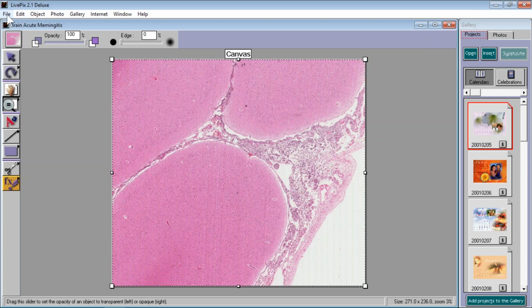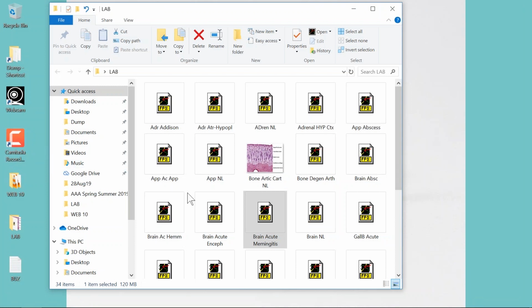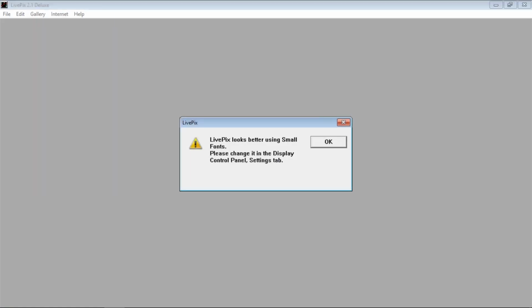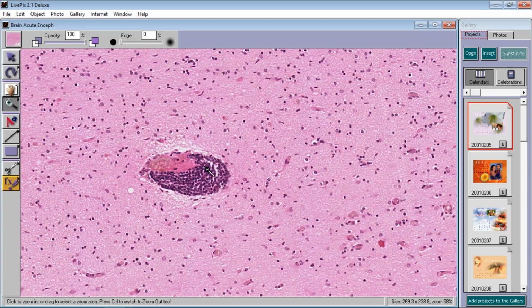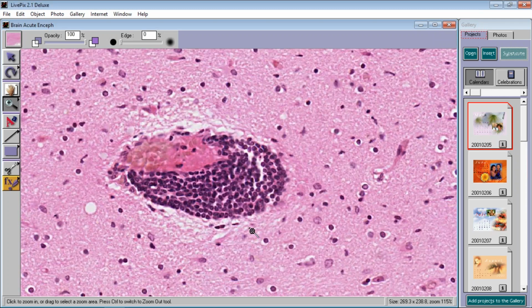Okay? Now, the reason why I'm saying that is because now we're going to go into a situation in which we have brain again. And at first you might say, well, the meninges are fine. Look at that. But you say, well, what about these little areas here? Let's take a look at that. Now, even though the meninges look fine, you have infiltrations of chronic inflammatory cells or lymphocytes. You see they have practically no cytoplasm around blood vessels. So now we have an inflammatory process going on in the brain, and it looks like it's primarily early or perivascular. But if this inflammatory process got worse or progressed, it might not only involve just the perivascular space, but much of the brain substance as well.